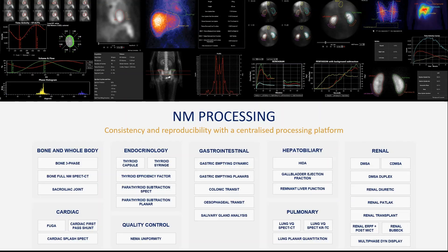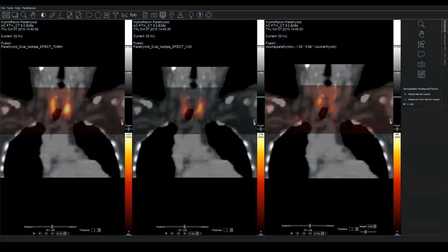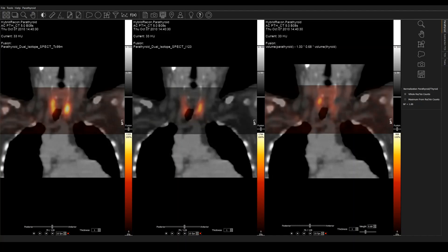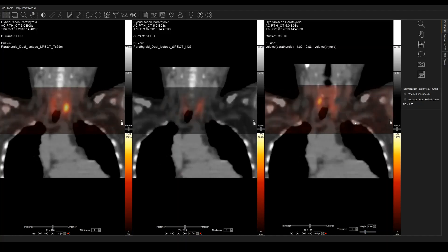For parathyroid subtraction, we can process either SPECT or planar data. We have a technetium MIBI SPECT in the left hand panel, so that shows parathyroid and thyroid. In the middle panel, we can see an I-123 SPECT, so just thyroid. And on the right hand side, we are subtracting the two acquisitions. And then we can adjust the weight slider down here to get the best result to visualize the parathyroid adenoma.